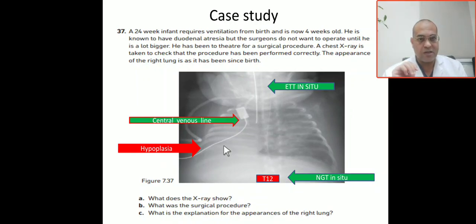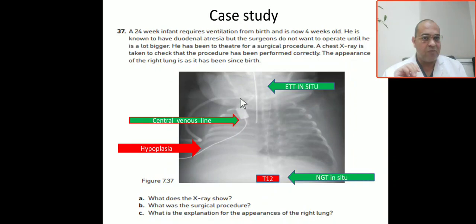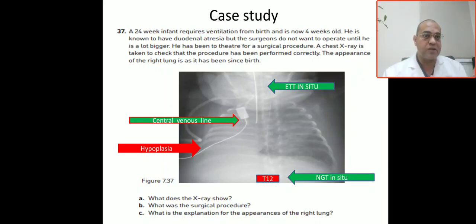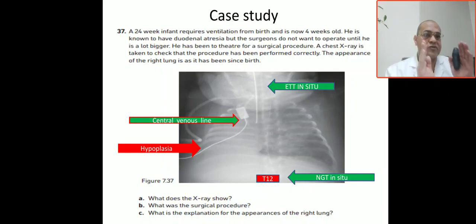There is another line here — this is the line for the surgical procedure done for this baby. You can see it here: this is a central venous line. It comes from up and goes upward through the superior vena cava until it reaches the right atrium. This line represents the surgical procedure performed — insertion of a central venous line.